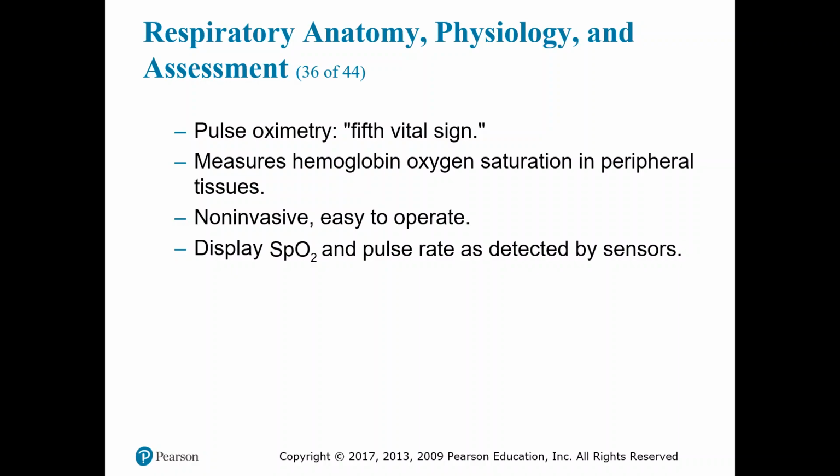These measurements use various devices and methodologies that, when used alone, have their limitations. However, when used together, they can provide a very comprehensive and reliable picture of the patient's respiratory status. When we look at the next table, we'll see how they can work together.